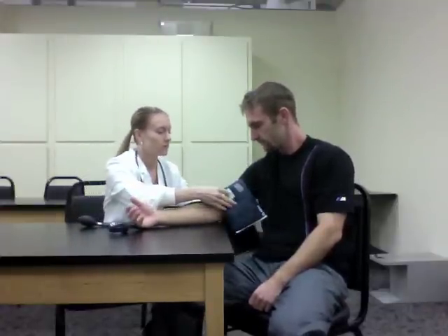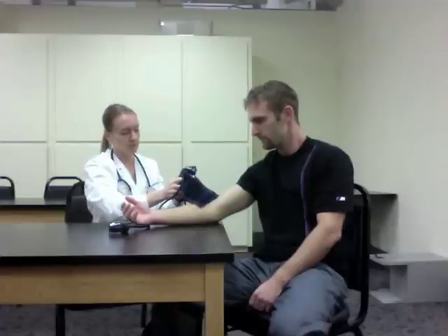In order for correct blood pressure measurements to be performed, the subject must be in a resting, seated position with good posture and feet on the ground. The arm being tested must not be elevated, as isometric contractions will result in false readings. Instead, the arm must be comfortably rested on the surface so that the midpoint of the upper arm is at the level of the heart, or the fourth intercostal space. The subject should not have sleeves rolled up, as this may result in a slight unwanted occlusion of blood vessels.